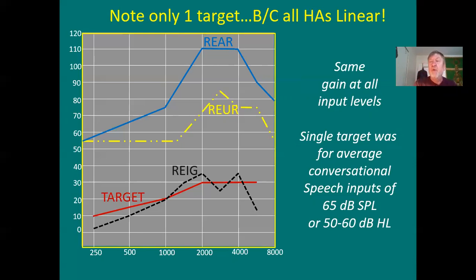That's why in your 130 course and in your advanced audiometry, when you're doing MCL measurements, a normal MCL is around 50 to 60. That's a normal MCL. Normal UCL, anywhere between 90 and 110. Okay, basically. And then, of course, what's a normal UCL in dB?